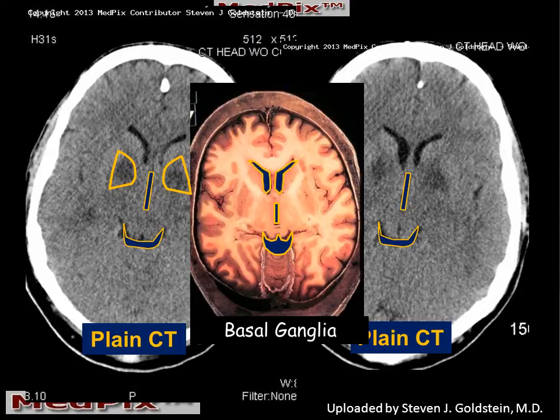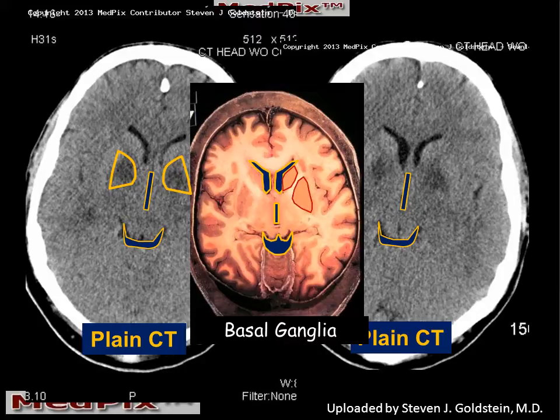We can see the frontal horns of the lateral ventricle, and we want to remember that the frontal horns are partially shaped by the head of the caudate nucleus. We have the lateral lenticular nucleus, and we have the gray matter of the thalamus, all arranged as we see here on the brain slice.